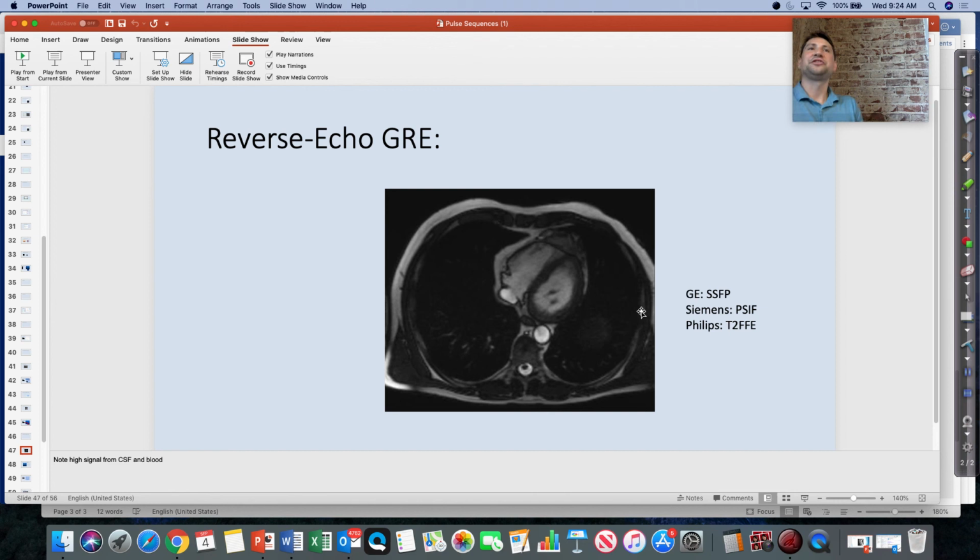Sometimes on the registry, you don't really need to remember the rewinding, the reverse, things like that. The main thing you need to know is that an incoherent gradient echo is T1 weighted. A coherent gradient echo is T2 weighted, T2 star. So it's really just like I did with that review game. It's really just associating things. You don't have to memorize these concepts. Just being able to associate things is the key for when you take the registry and when you take my test.